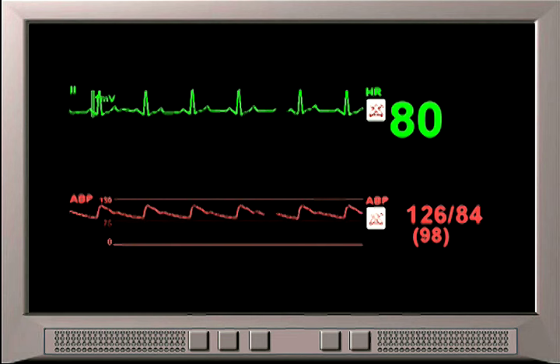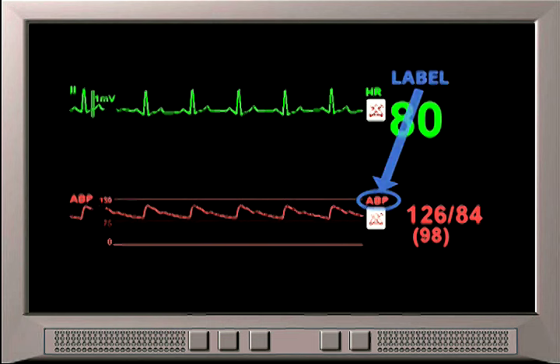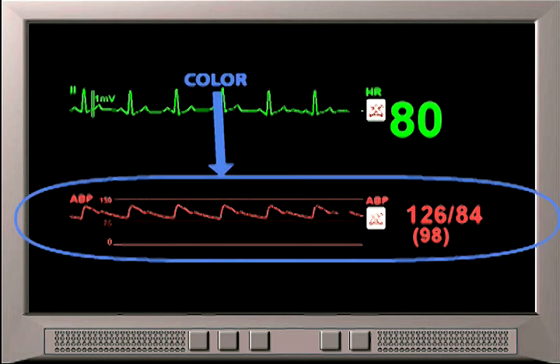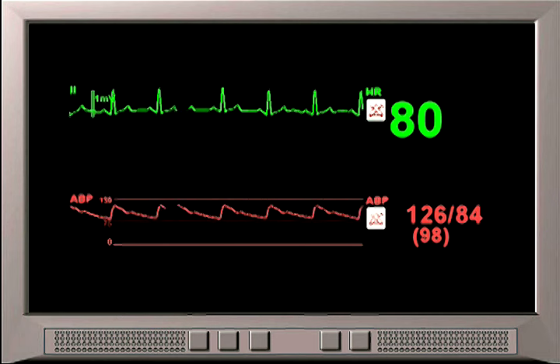Confirm the pressure channel has the appropriate label, scale, alarm settings, and color coding for the physiologic pressure being measured.